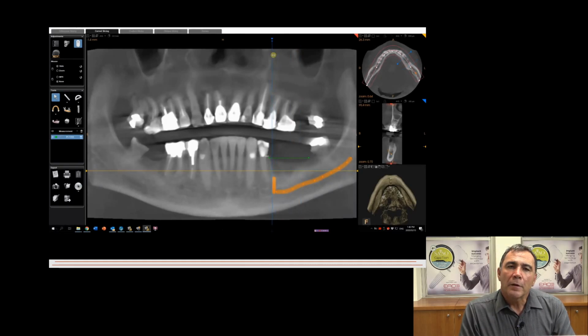So remember, this is only the planning stage. I'm not talking about further software digitization and planning. This comes afterwards and is much more in detail.